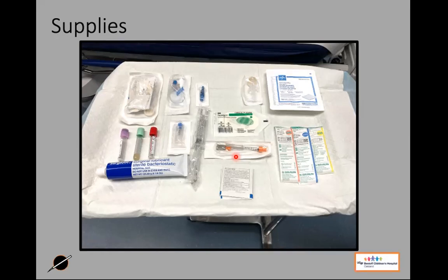What I have found over the last few months of using it, we actually get very little vasoconstriction. So we get all the benefit of numbing up a nice area where our needle is going to go in. The patient is less hesitant. We can pass through that area, and it maintains the integrity of our blood vessel. So I'm not saying it's mandatory, but I would advocate for trying it out.